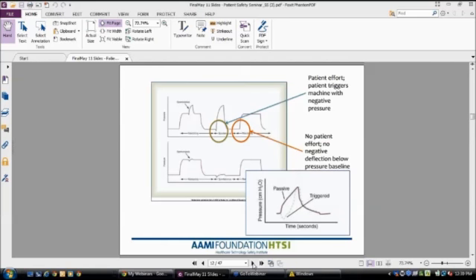the breaths, the pressure has gone to baseline. We're on a pressure scalar here, pressure time scalar. So as you can see, the pressure goes back to baseline after the initial breath is completed. You can see a small negative deflection from the baseline before the spontaneous breath is given. That's our patient trigger. So in this particular example, the patient trigger is pressure.